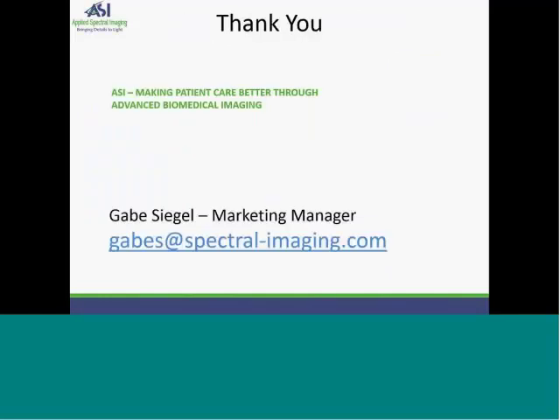So at this point in time, I would like to switch the presentation to the software and show you how the actual workflow appears. Following the demonstration, I will answer any questions which were sent in. And I have placed my email address on the screen should anyone wish to send me a question at a later point. So please hold on while I switch screens to the software.